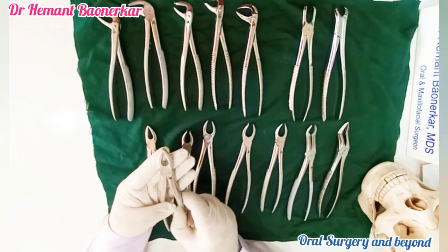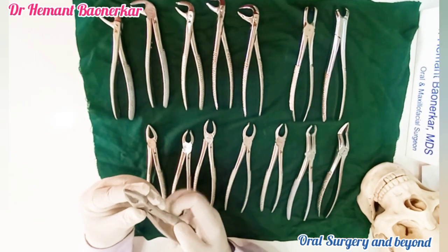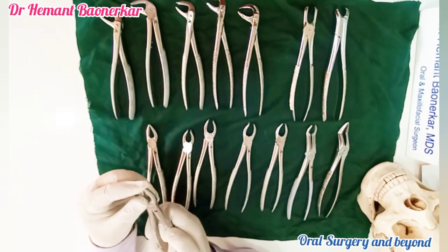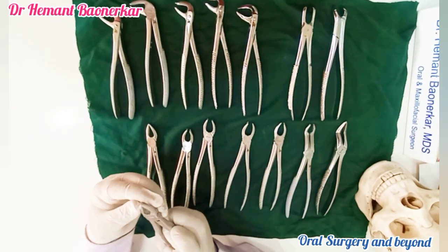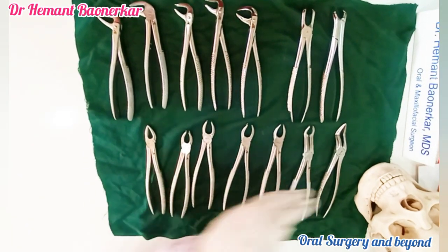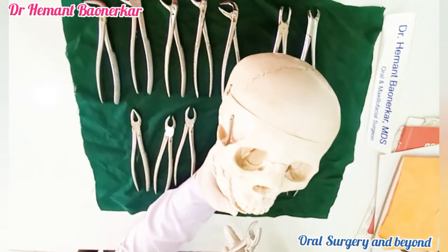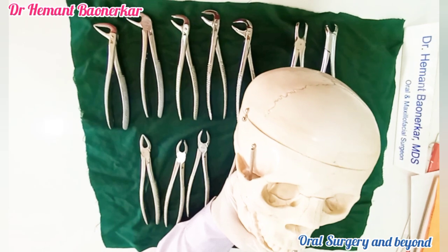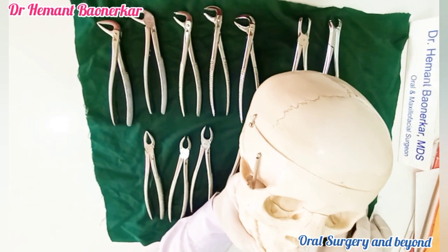This is basically a maxillary anterior extraction forceps. We can see there is no space between the beaks of the maxillary anterior forceps. We can hold this extraction forceps like this and use rotational movements to take out the tooth.